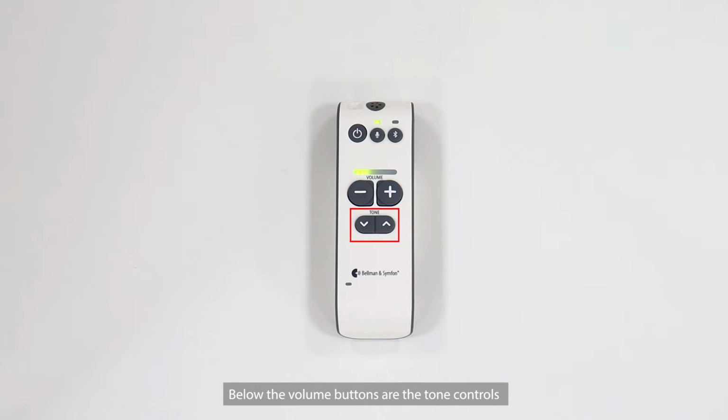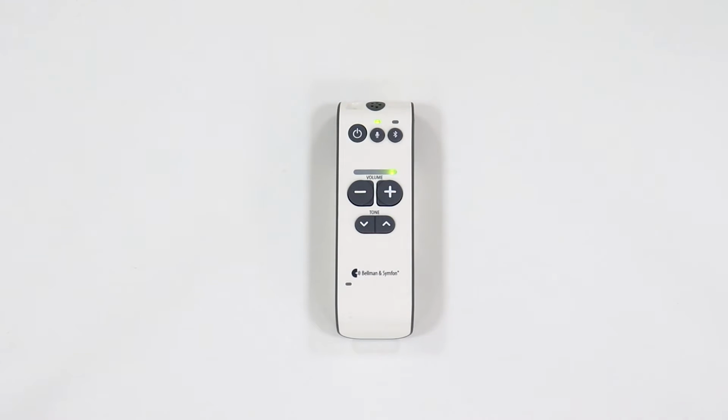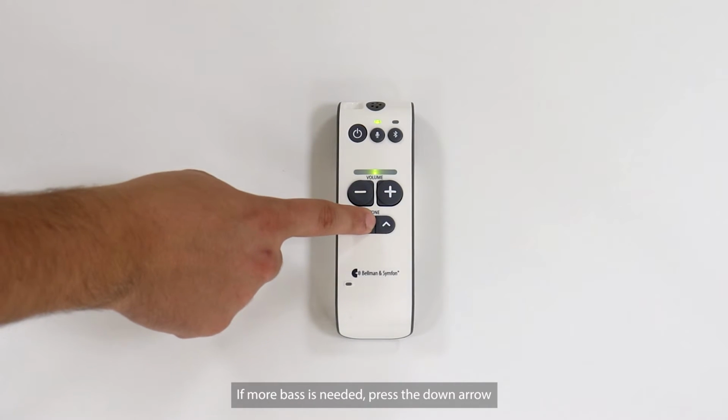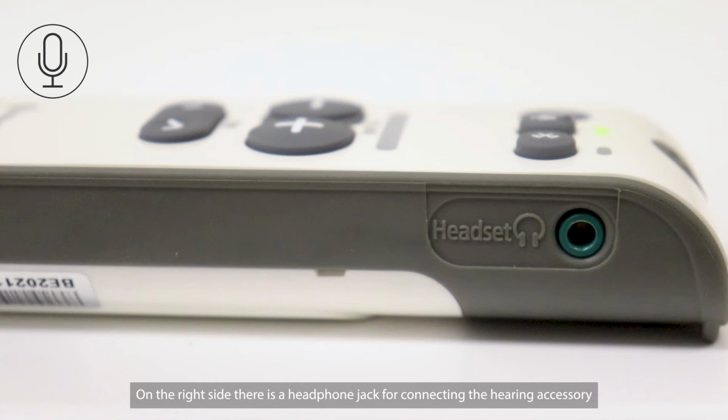Below the volume buttons are the tone controls. If you need more treble, press the up arrow. If more bass is needed, press the down arrow. At the top, there is a yellow charging port for charging the device. On the right side, there is a headphone jack for connecting the hearing accessory.